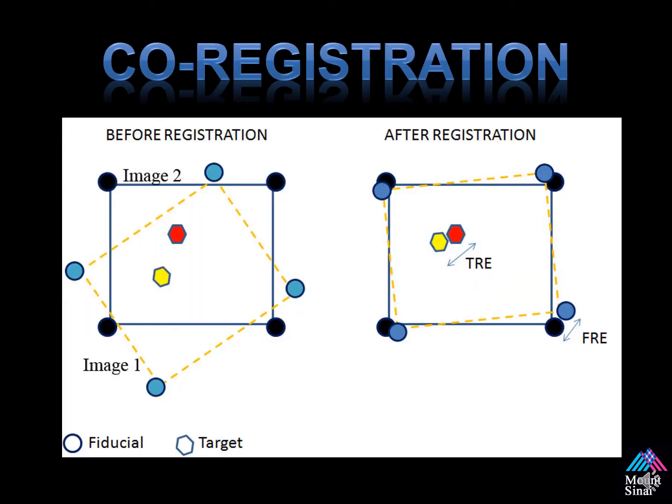A little bit simpler: see image 1, the dotted yellow box, and image 2, the blue solid box? These two data sets are not aligned. But after registration on the right side of the screen, you're able to see where the two data sets line up. Those dots — the blue and the black circles — are similar to our triangles, where we're trying to line them up as best as possible to allow for co-registration between the two image data sets.